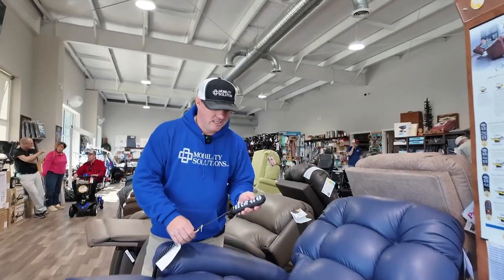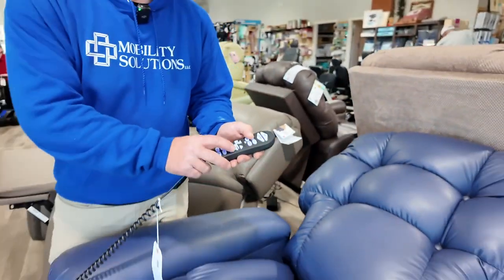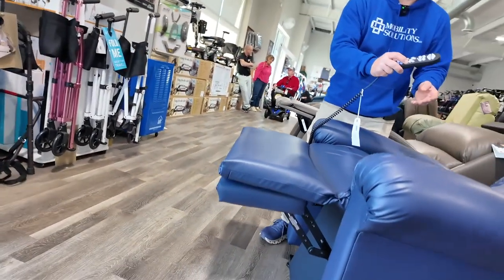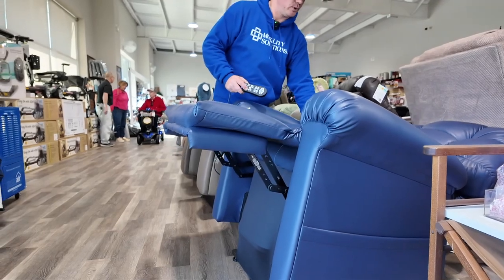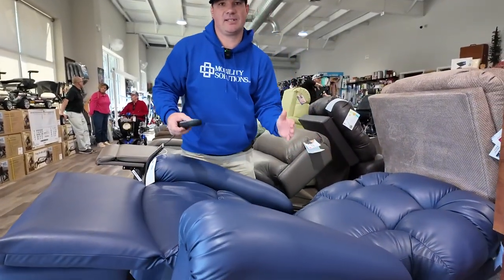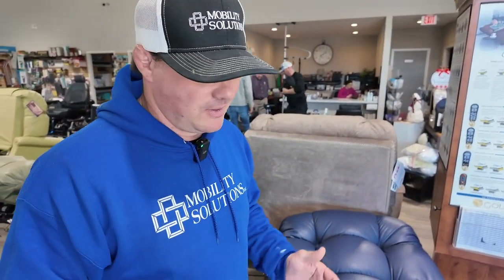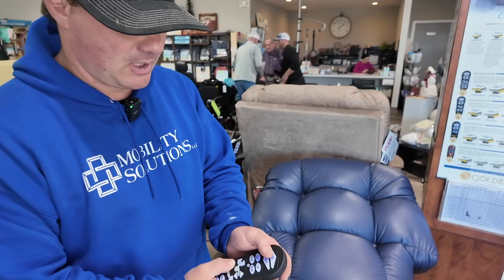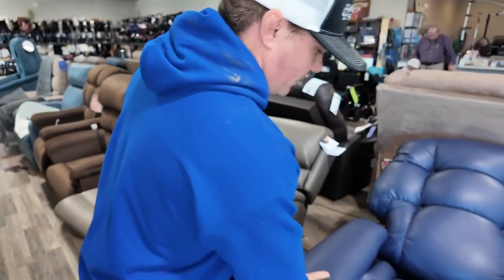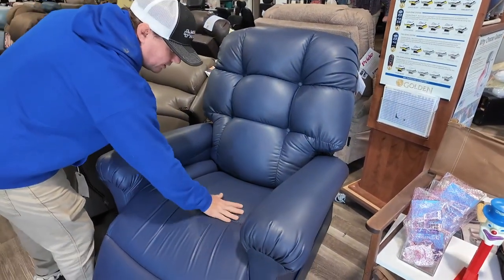You also have what we call zero gravity, which is just a rejuvenate position. When you activate the Twilight technology, it raises the front of the chair up to 30 degrees, taking the pressure off your lower back, your butt, and redistributing it to your shoulders. So if someone is going to be in this chair for a long period of time, it's good to get in this position for about 30 minutes to an hour to redistribute weight. This chair also has an overstuffed arm and a nice soft memory cushion.